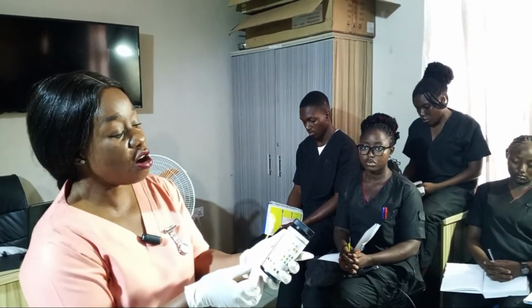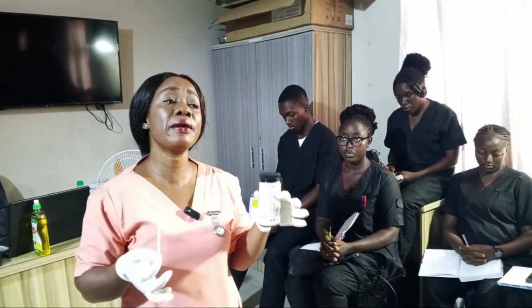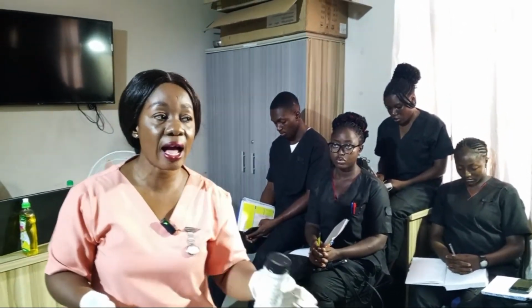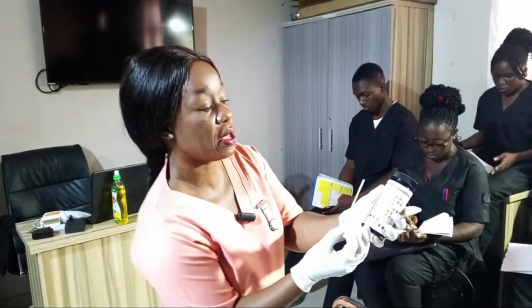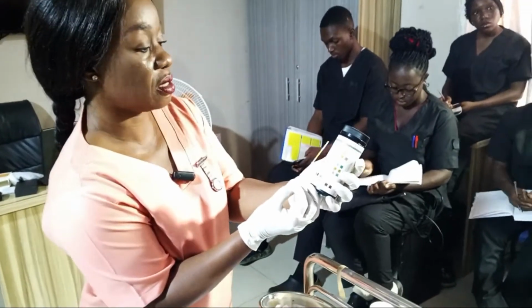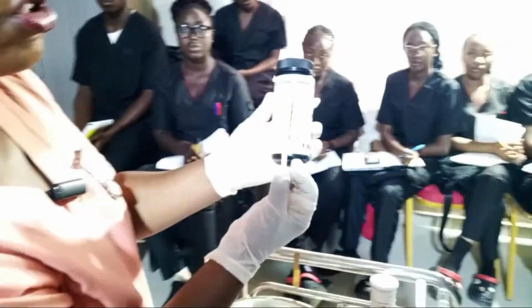So most of the chemicals here, remember I told you that when you are carrying out urine testing, we have physical and chemical, isn't it? So we have done the physical aspect of it. We have entered the chemical aspect of the urine testing, right? So now we compare. You place it this way, close to the bottle. Do not allow it to touch the bottle, right?